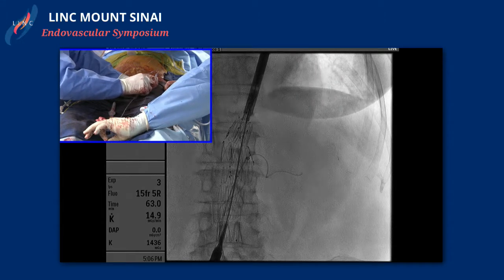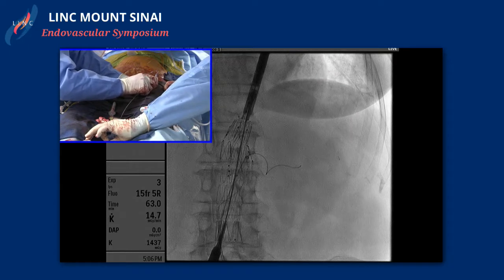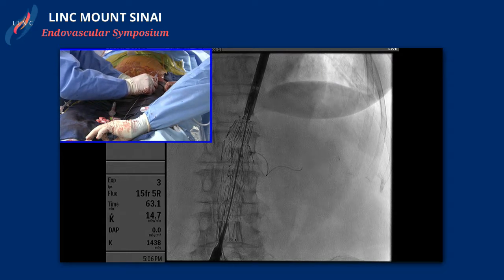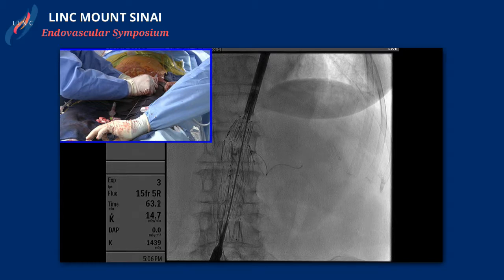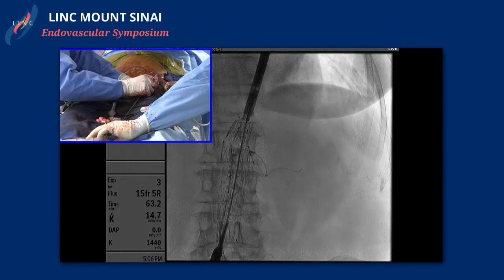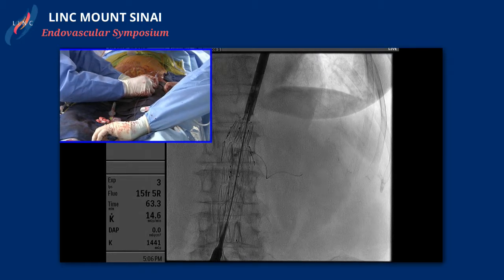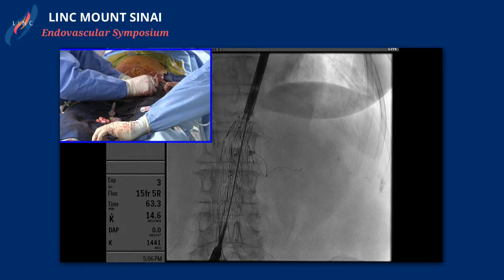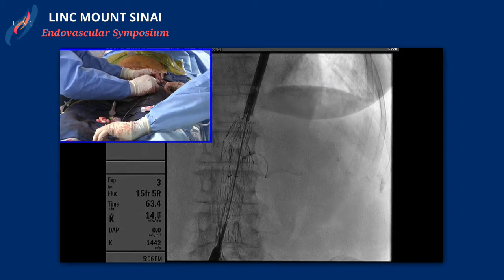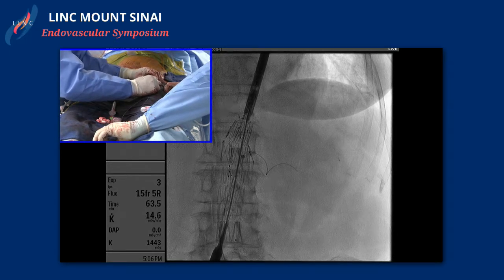This is where it comes in — people forget that as you're advancing a catheter, if it forms a loop or a bow outside the body, it pulls your wire back. That's the place that's been giving us fits right there. Advance wire a little bit. A lot of groans in the audience because it seems like we've all been there where your wire starts backing out on you. Are you able to push your sheath up anymore? But that's what can happen.